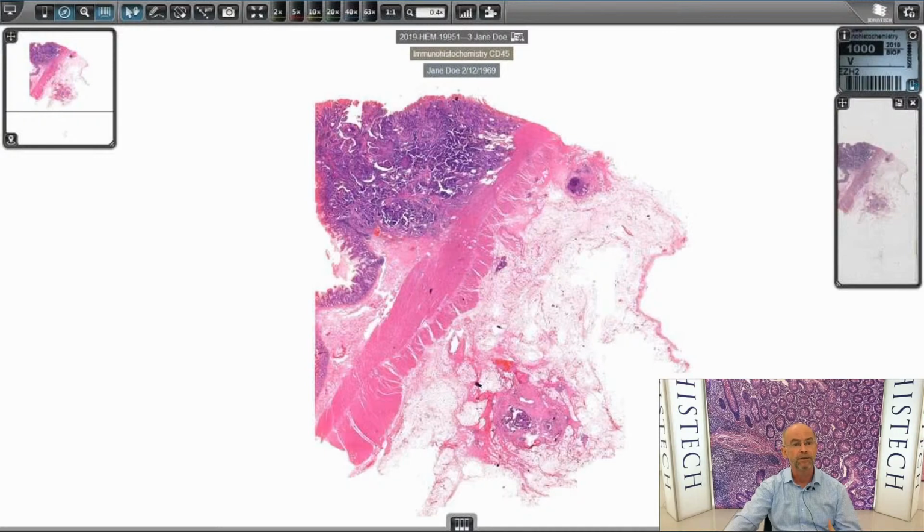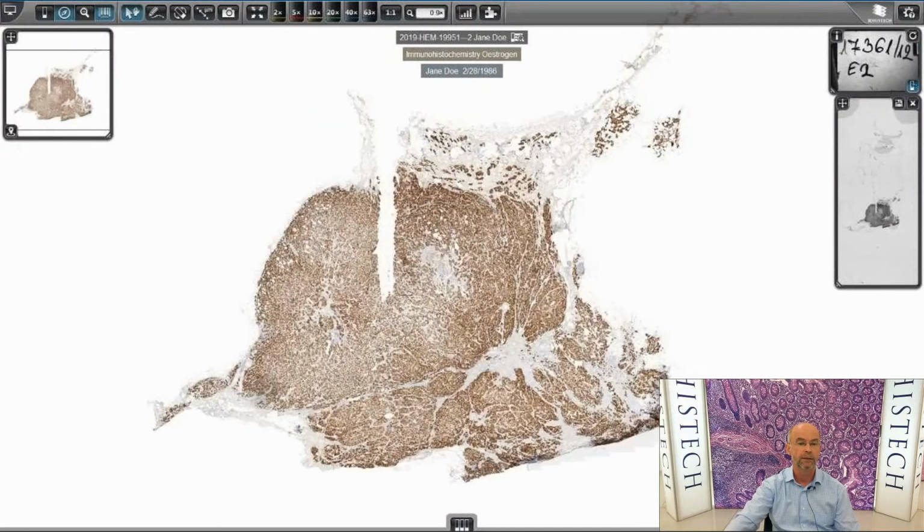And then here you see the difference. You have to define the patient, yourself, and the time and place of the evaluation, which will be recorded in the case file and added to the case evaluation profile.